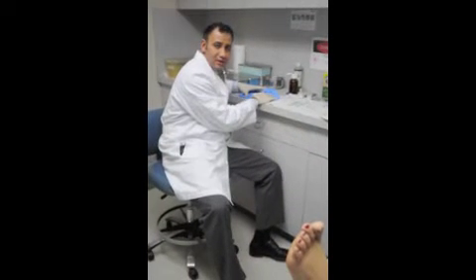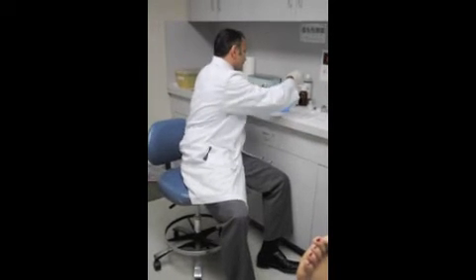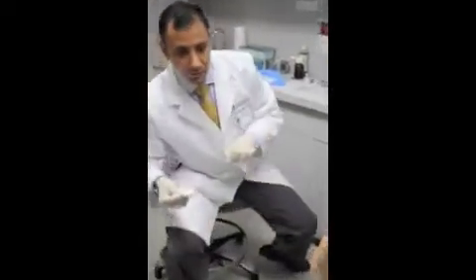So we're going to do an iodine starch test. This is done before a Botox procedure to determine what areas have hyperhidrosis or excessive sweating. First thing we're going to do is wipe the bottom of the foot with a bit of alcohol, just to dry it — alcohol is a drying agent.